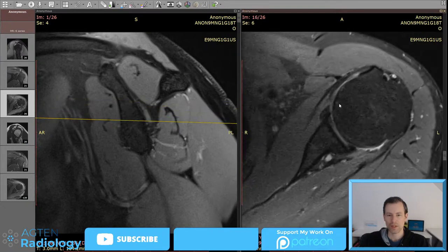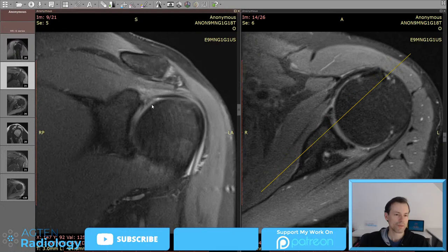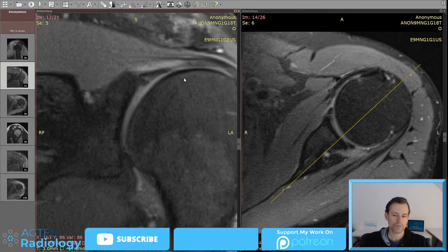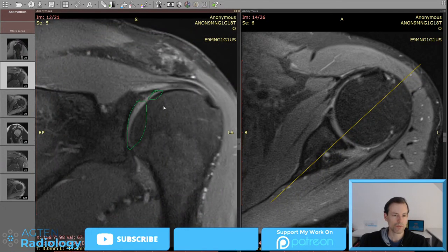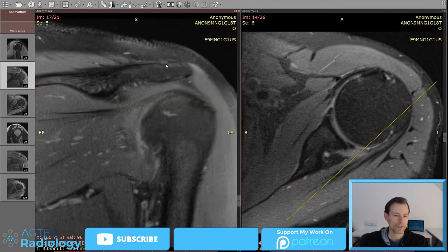Yeah, so I don't see any major cartilage defects. He's 50 something, right? Just quickly checking. Yeah, 50 something year old. Now, one site where you have to look for these cartilage defects is up here. Frequently, we miss cartilage defects in this area. We tend to always look here, but frequently they are at this level. So next time, go check there. Yeah, I think that's all I had for this case.